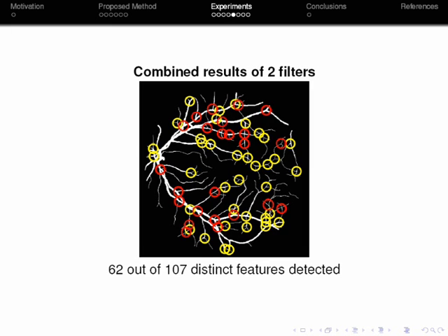Applying the new filter we are able to detect 40 new bifurcations. And when we combine the results the two filters detect more than half of the bifurcations. To be precise they detect 62 distinct features out of the 107 bifurcations.